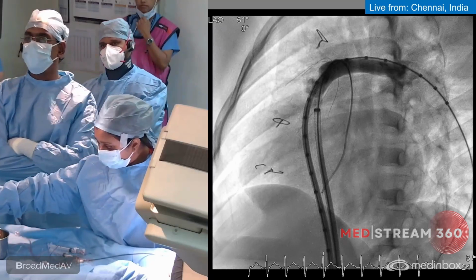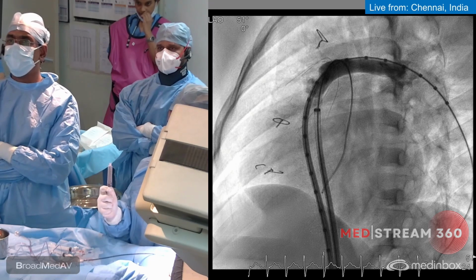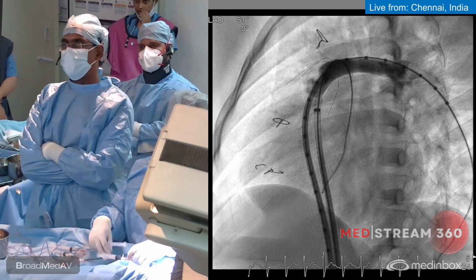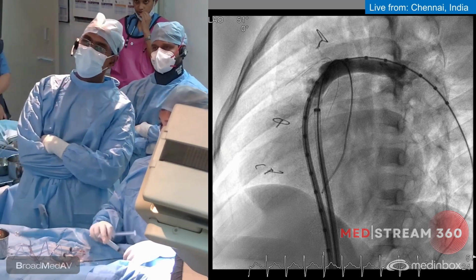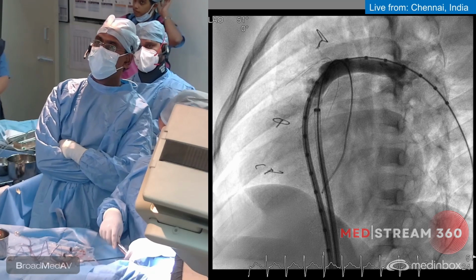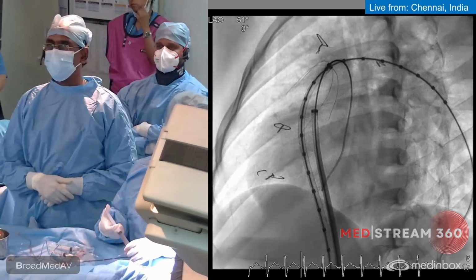Can you freeze it? Okay. I think we have a reasonably good quality image. It looks like the left pulmonary artery may need an even longer stent. It may need almost like 4 centimeters. Let's make some measurements.